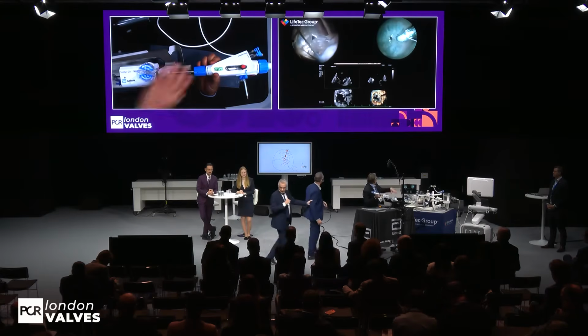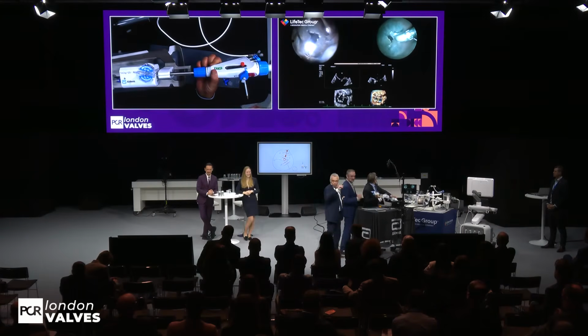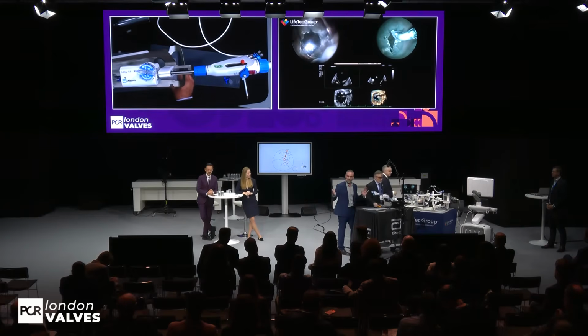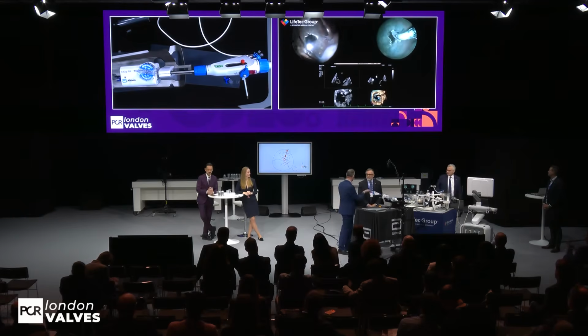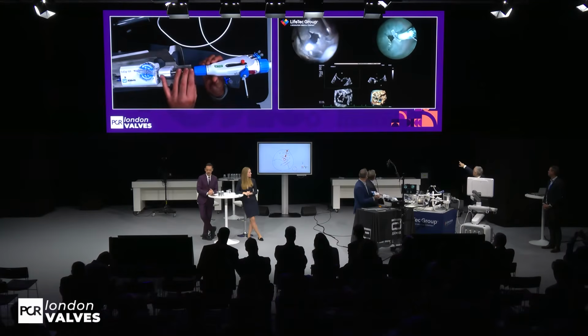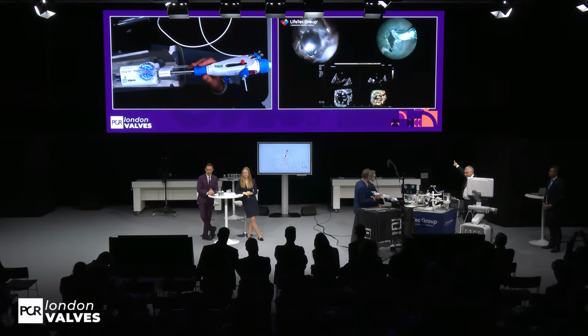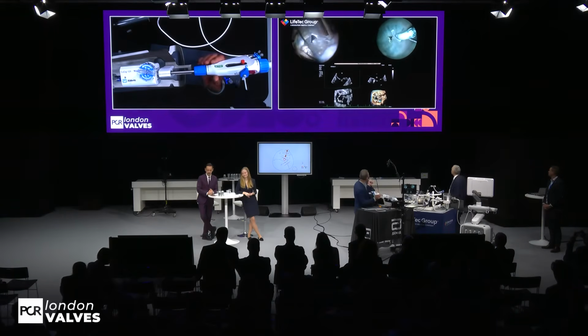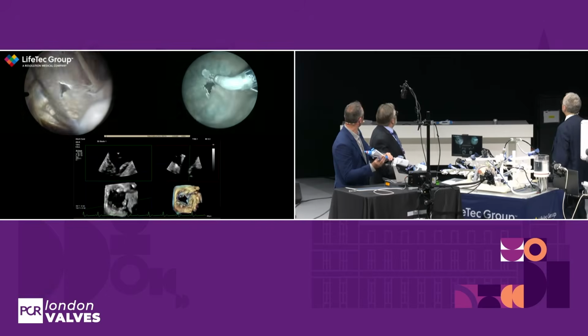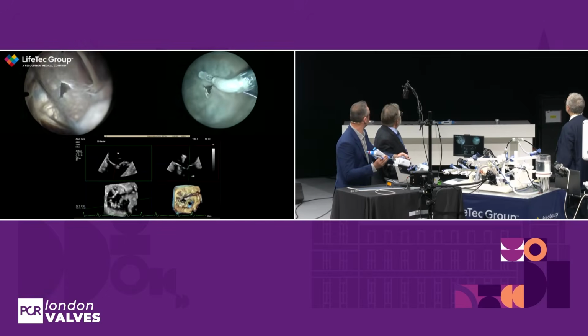He's trying not to do the case. Talk, no, blah, blah, blah. But you have to do it. Yeah, you do it. No, you do it. Okay, so I'm going to do what the majority wants. You know what I did? I was helping you. I just put the MPR ready for you. But you want me to go posteroseptal? You want me to go anteroseptal? Anteroseptal, easier. Okay, so then this is posteroseptal. Look at the diagram. Paul is trying to help you. Okay. Go easy. Do the easy thing. Just unflex, no?